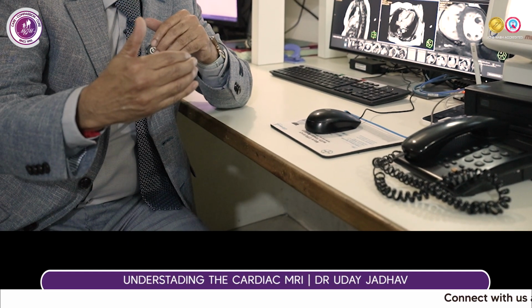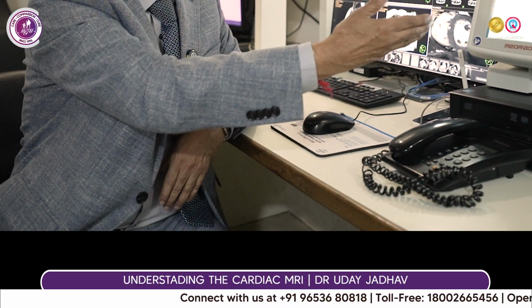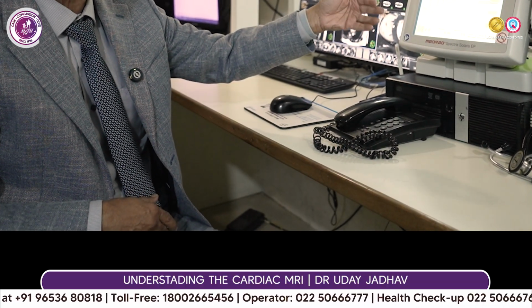And through this structure, once we finish the first phase of the scan, which is called a plain scan, the second part of the scan would involve injecting the intravenous contrast called gadolinium. And that's done through this injector. This is an automated injector which decides how much dose we are supposed to give. And once the contrast is injected, then we get the entire images that tell us about the structure and the function of the heart.